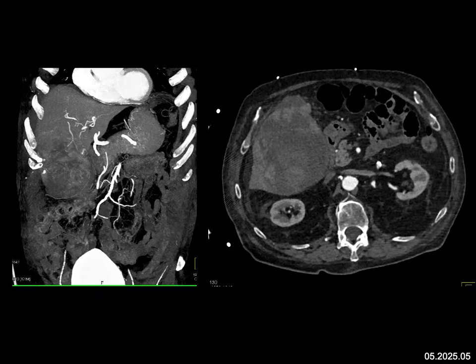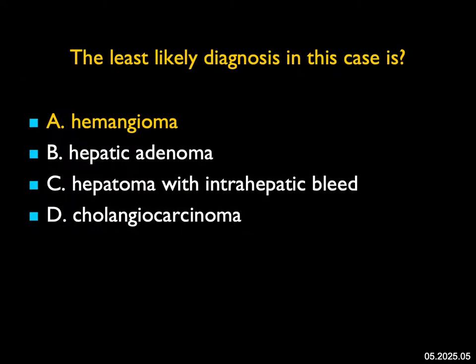Hemangiomas can bleed, but typically with hemangiomas there's prominent peripheral puddling, and this has none of that vascular-type appearance. So hemangioma is the least likely diagnosis. This to me is a malignant tumor.